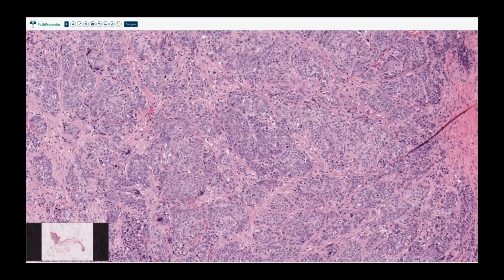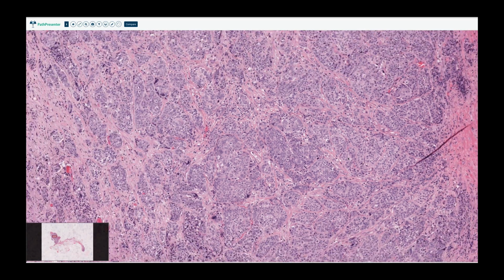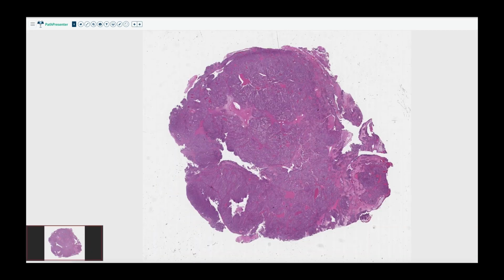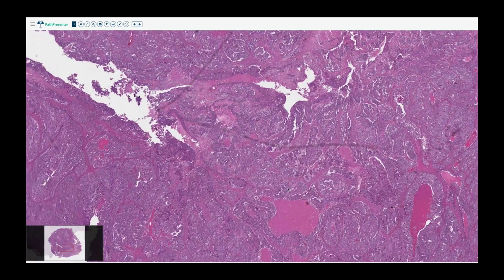This is high-grade serous carcinoma, and how do we know it's high-grade? Well, you go down to high power, you can see there's a lot of mitotic activity. There's also pleomorphism, meaning that the cells look different from one another. You have atypical mitoses, not just mitotic activity. Macronucleoli, so nucleoli you can see at a relatively low power. And yeah, the nested architecture, and you can clearly see that this is some sort of fibroadipose tissue, and it's clearly infiltrative. And then I think we have one more example here of serous carcinoma, which is high grade.